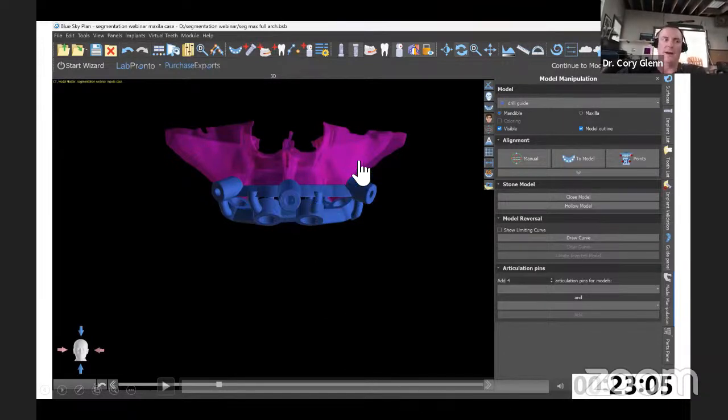But it's going to be per item, so if you did a swappable case, you're going to do 150 for the reduction, 150 for the drill guide. But really, if you're doing stackable, you're looking at the same thing because you're going to have 150 on the reduction guide, 150 for the stackable portion on top. So it might beg the question, why not just keep it real simple and do a swappable guide case?